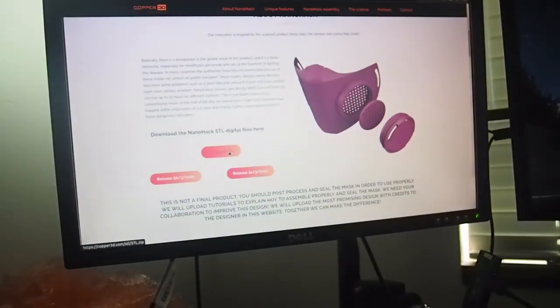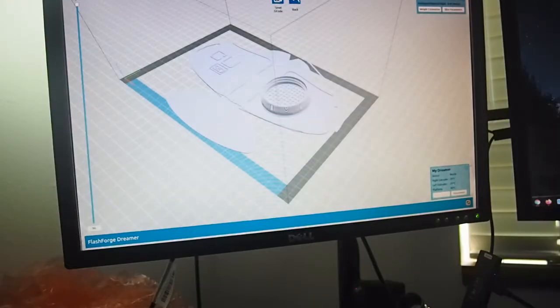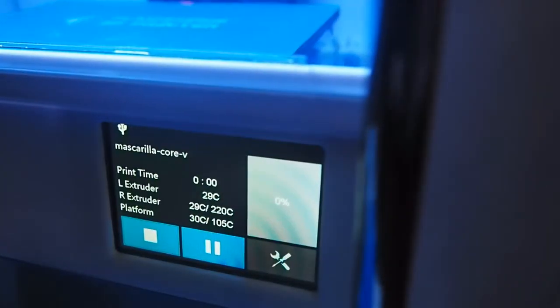Hit the download button, download the STLs. You're going to unzip it. There's going to be a version 5 file. So I have the version 5 here. And I've already sliced it with the 20% infill as the instructions recommend. So all we've got to do now is hit send, and then let's see if we can catch it. So this is being blasted over the serial connection over here to my board, and here we go. We're off to the races.